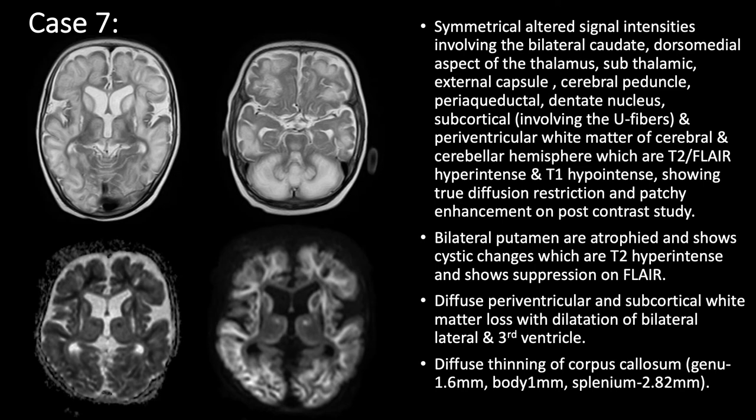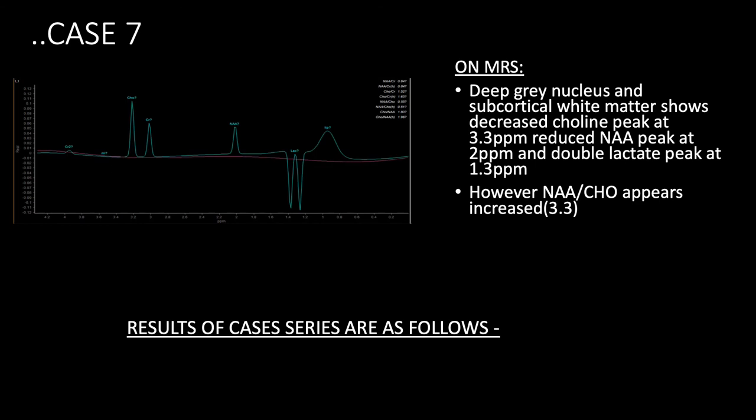This is a case of a 5-month-old male patient, which shows bilateral symmetrical T2 FLAIR hyperintensities in caudate and dorsal medial aspect of thalamus, periaqueductal and dentate nucleus, which are showing diffusion restriction. There are other MRI findings of hypoxic ischemia also present in this case. On MRS, it showed double lactate peak.